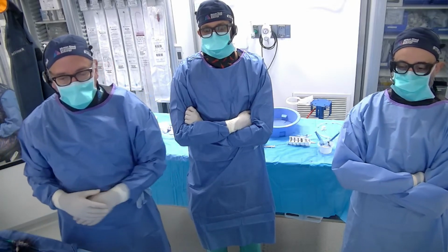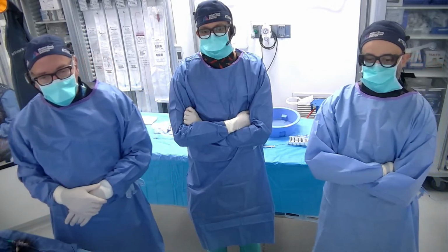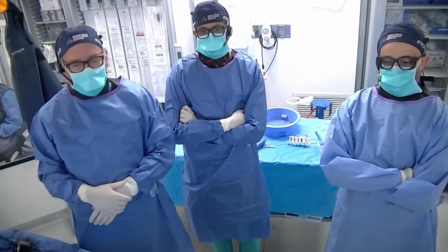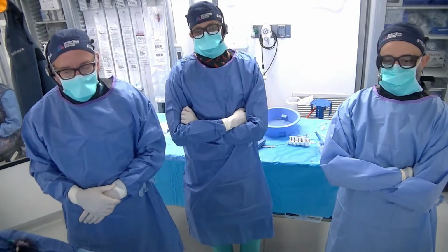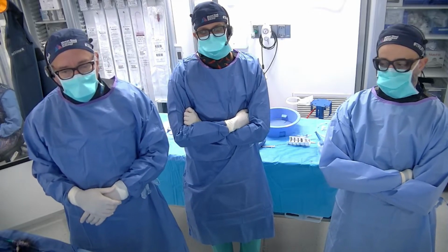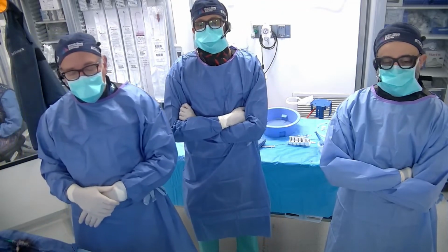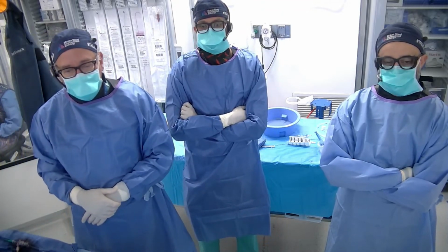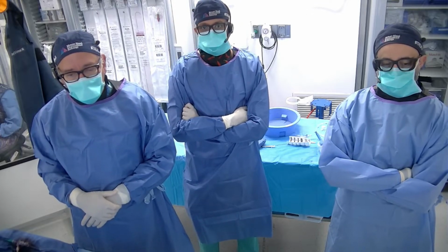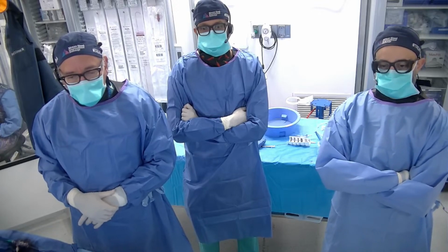Well, you went radial, and so I think you'd have to go out of your way to treat the iliac. If you were going femoral and it was causing you problems to access, it might make sense to go ahead and intervene along the way. But having gone radial, and he's a claudicant, while we know treatment of significant aortic occlusive disease certainly helps claudicants, I'd say focus on the task at hand. His biggest issue is hypertension. I'd focus on the renal arteries.